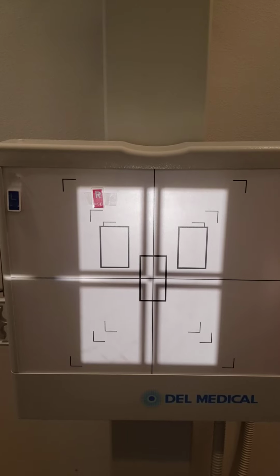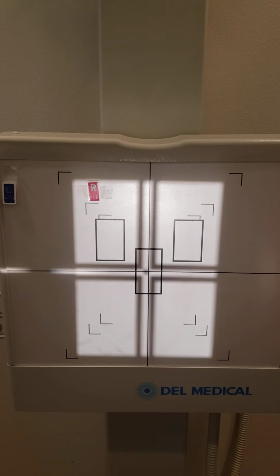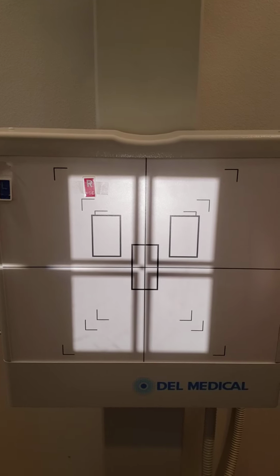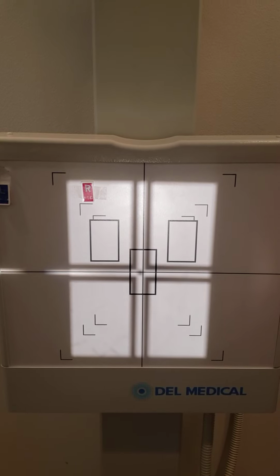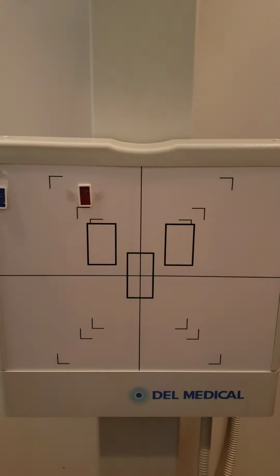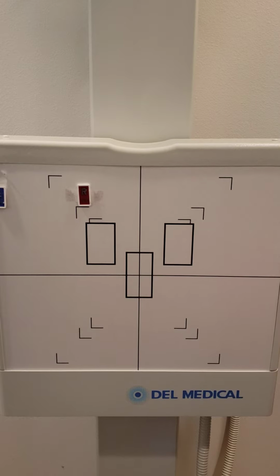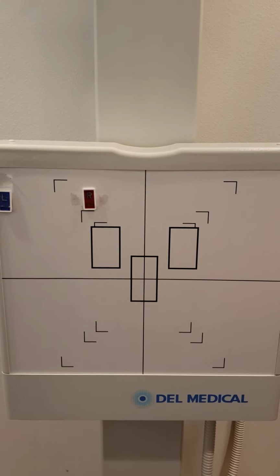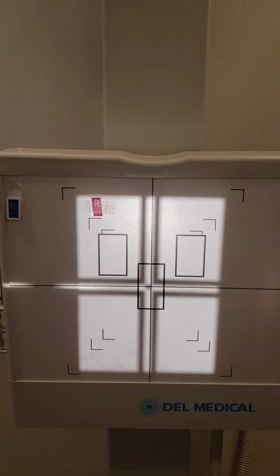So this position will be for the ribs. We're going to do unilateral ribs, visualizing rib 1 through 12 at the same time. We're going to start with the true AP, and this will be to visualize the right posterior ribs. I've got approximately a 12 by 17 portrait or lengthwise collimation, and I have my right marker here. So we're tube film aligned.